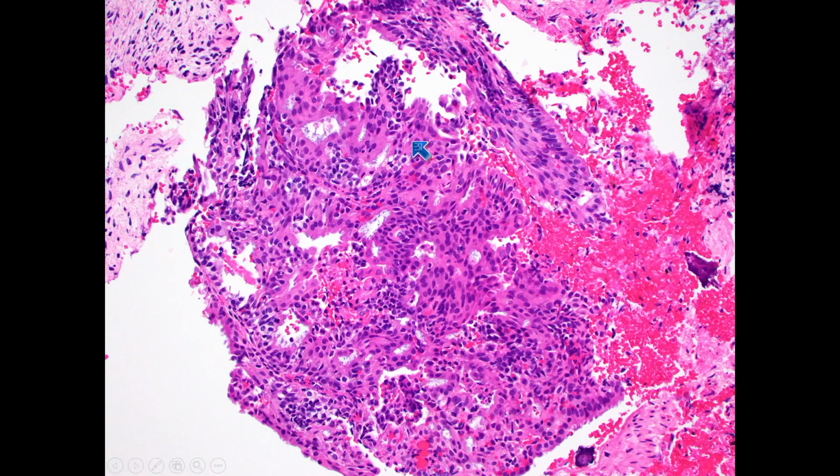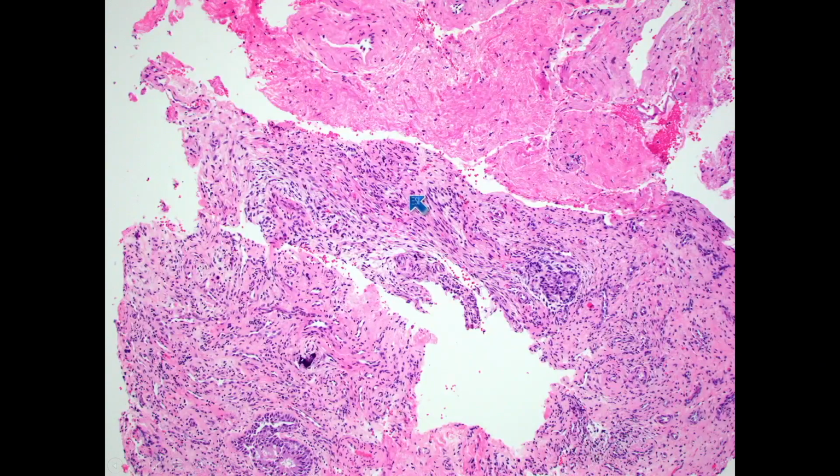But then we started noticing other areas in this biopsy which were a little different and a little weird, areas like this, where there is a proliferation of almost benign appearing glands, very bland, but again, proliferative. So the question is, is this part of the tumor? Is this some weird surface glands that are rolled up and faking us out? And then other areas of the biopsy look like this, vaguely, mildly spindled. So again, we wonder, is this part of the tumor? Is it just a reactive stroma? So a lot of different signals going on in this particular biopsy.